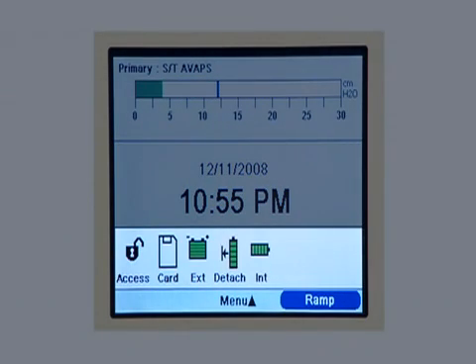The status panel at the bottom of the screen displays informational symbols. You may see an open lock, which is a feature used by your home care provider. You see this symbol when the secure digital or SD memory card is in the slot. If you see this one, there's an error with the SD card. When an external battery is attached, you see this. When the symbol is green, the battery is fully charged. The level of the green shading will go down as the battery charge decreases.